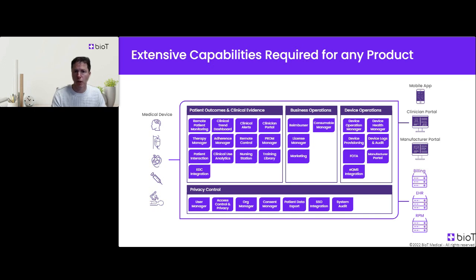You need to support firmware updates usually. Even though most of the software is on the cloud, some must stay on the device itself, of course. We will have to provide some portals for teams who are not developers but want to get some understanding of devices that are connected or disconnected, or other use cases as well. So quite a lot of functionality, even for a basic product.